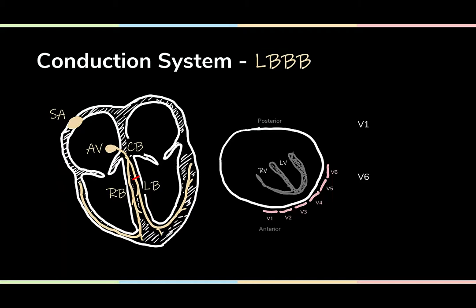You didn't know that? Okay, so what's that going to do to the QRS complex on the EKG? Yeah, it's going to widen it. Exactly, because now we're traveling slower through the myocardium. You actually get a wide QRS complex.